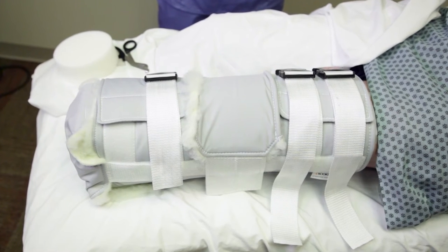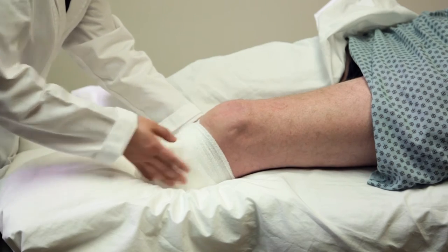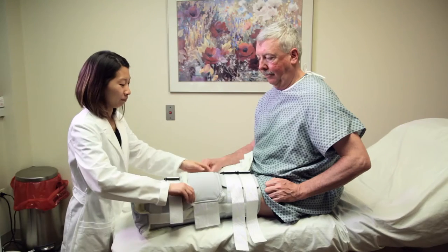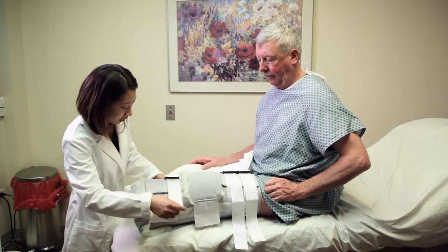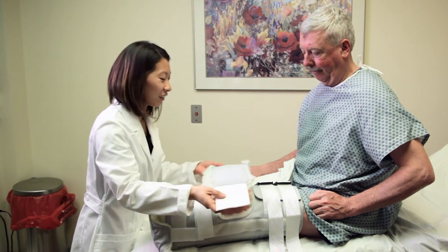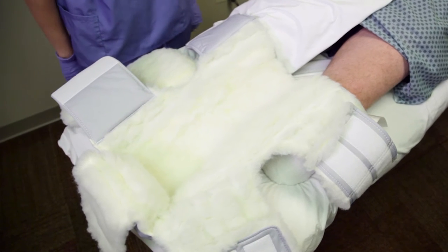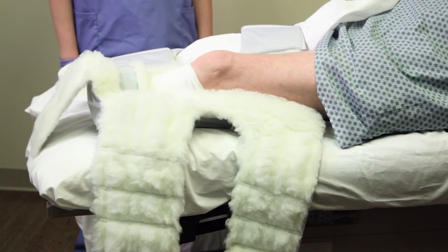The Rook BKA rigid dressing with soft interface is a dressing designed for immediate use after a below knee amputation surgery. The Rook BKA dressing provides superior protection to the residual limb and maintains the knee in a neutral position with the patella immobilized to reduce the risk of flexion contraction. The entire dressing also features Osborne Medical's famous 100% polyester fleece to maintain optimal temperature of the healing limb.